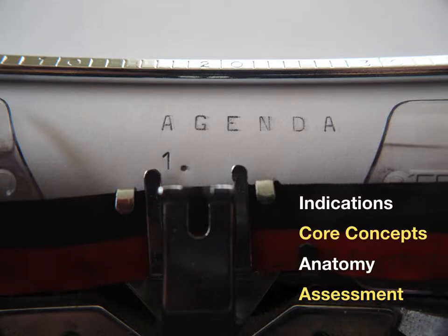While the entire category of soft tissue and MSK ultrasound is quite broad, in the emergency department, there are very specific questions that we like to answer with this type of ultrasound, and we'll talk about those indications. We'll also focus on core concepts to help you understand the principles of MSK and soft tissue ultrasound, give you a brief overview of sonoanatomy, and then help you develop an approach to common presenting soft tissue and MSK complaints.